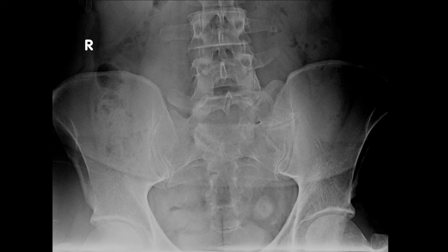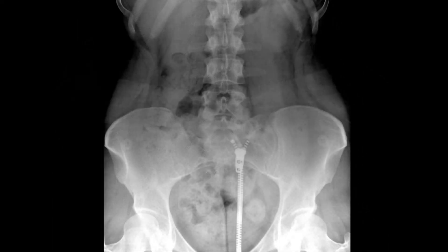Here is another example of a round non-calcified density on the left side of the pelvic basin above the bladder. This individual does have a few clothing artifacts including a zipper and some buttons, but in the left aspect of the pelvic basin there is a round non-calcified density.